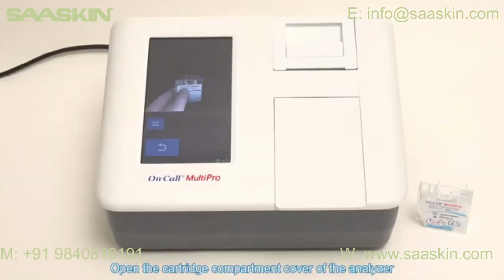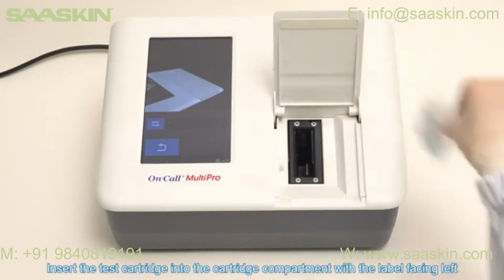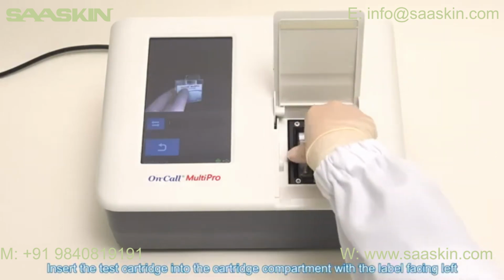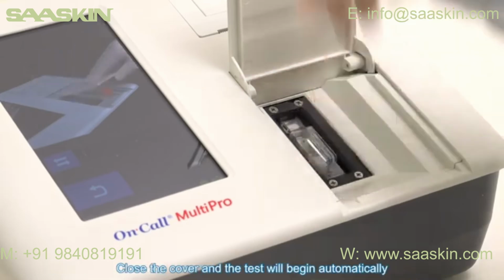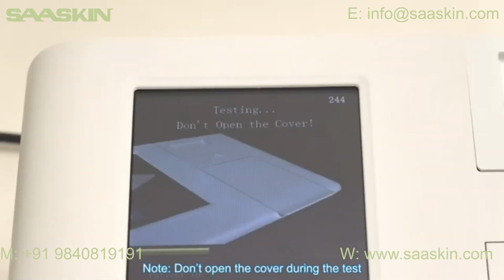Open the cartridge compartment cover of the analyzer. Insert the test cartridge into the cartridge compartment with the label facing left. Note: push the cartridge completely to the bottom of the cartridge compartment. Close the cover and the test will begin automatically. Note: don't open the cover during the test.